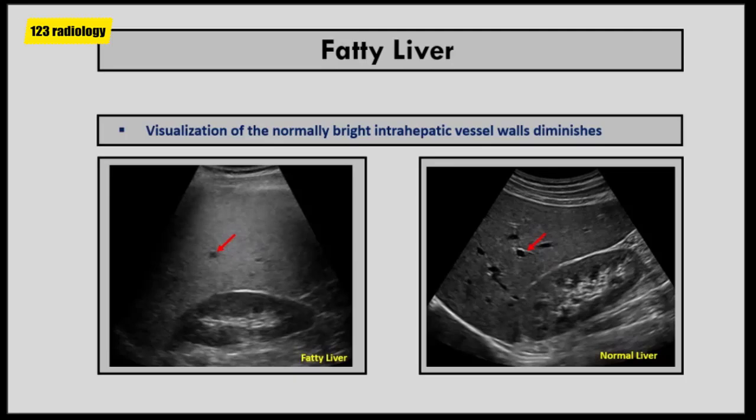Visualization of the normal bright intrahepatic vessel walls diminishes in fatty liver, because the surrounding liver tissue becomes more hyperechoic. In the normal liver, we can see the echogenic vessel walls. In fatty liver, the echogenic vessel walls are not visualized due to increased echogenicity of the surrounding liver parenchyma.